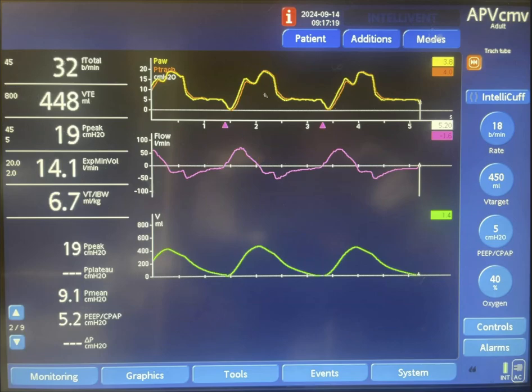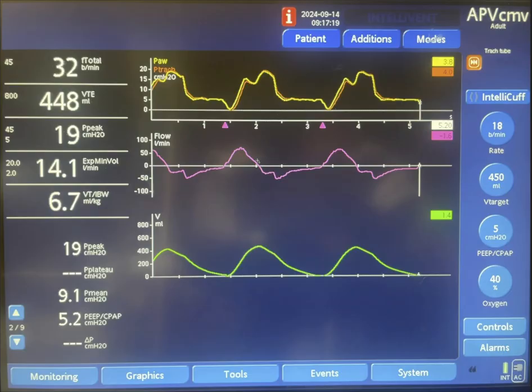What you need to do is shorten the inspiratory time on the machine. Currently it is set at around 0.9 seconds. You need to make it around 0.6 seconds. This way you synchronize the patient's expiratory efforts with the cycling time on the machine.